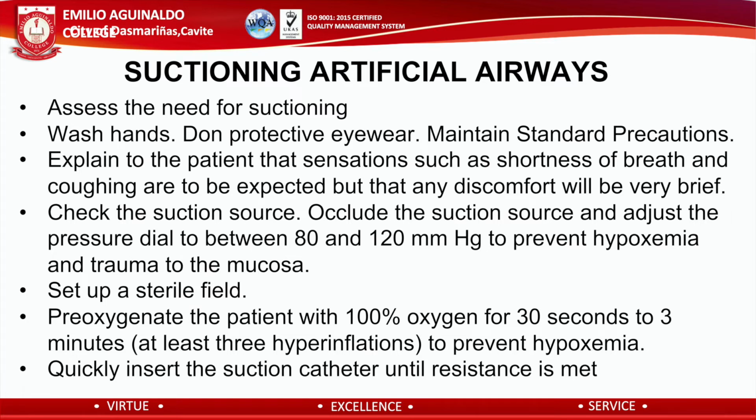Monitor the heart rate or use a pulse oximeter while suctioning to assess tolerance of the patient with the procedure. Assess for hypoxia. Assess the patient for increased heart rate and blood pressure, oxygen desaturation, cyanosis, restlessness, anxiety, dysrhythmias. Oxygen saturation below 90% by pulse oximeter indicates hypoxemia. If hypoxia occurs, stop the suctioning procedure. Using the 100% oxygen delivery system, reoxygenate the patient until baseline parameters return.